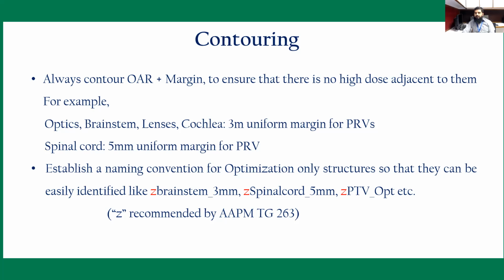There is a little bit of confusion regarding the spinal cord and spinal canal. The 5 millimeter margin is for the spinal cord, not for the spinal canal.